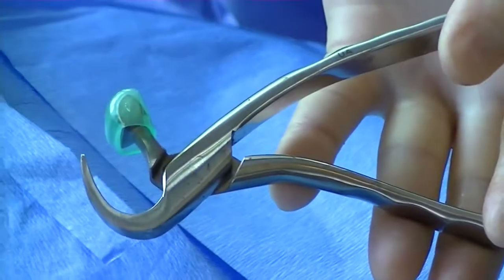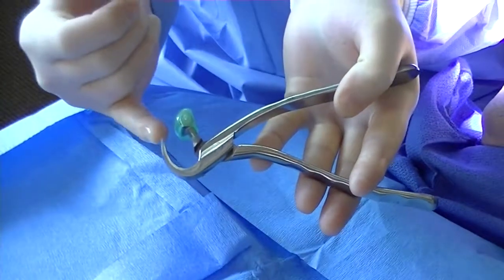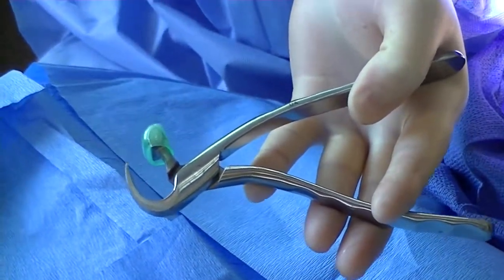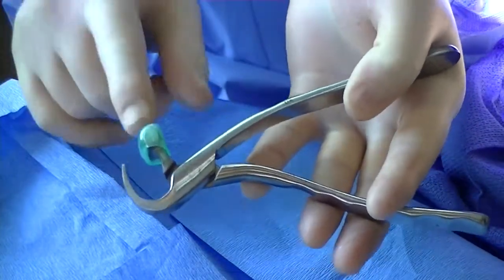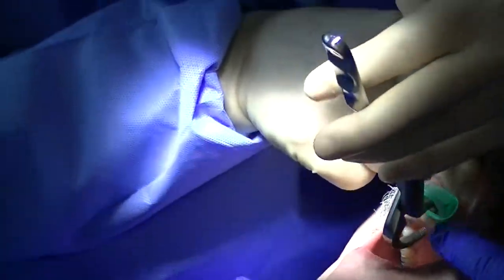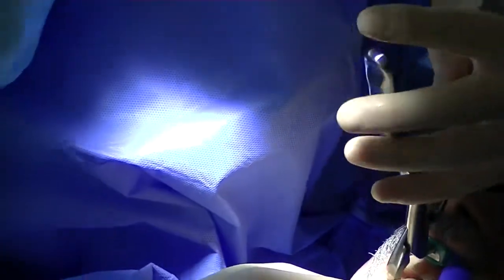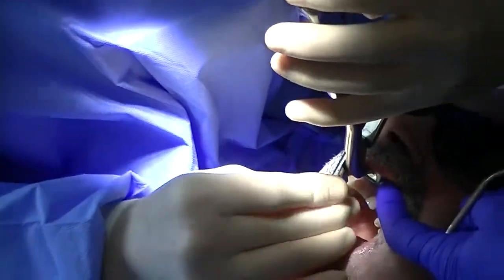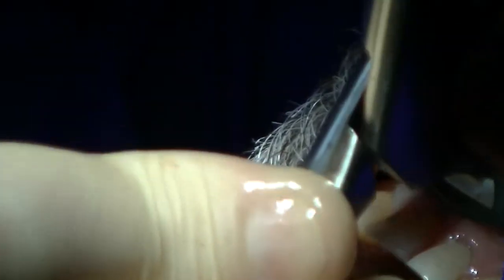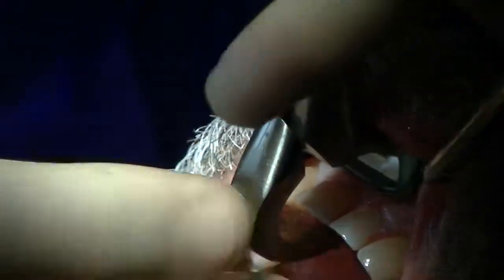Let's demonstrate the physics forceps here. As we talked about, physics forceps has two components: the beak, which is the shovel-shaped edge, which will engage the tooth root 1 to 3 millimeters subgingival. The bumper is simply a center of rotation, a pivot point. So you're going to feel a little pressure here, should have no pain, okay? And so what I'm doing is engaging the beak as far down the palatal portion of the root as possible, and placing the bumper as high up the vestibule as possible.